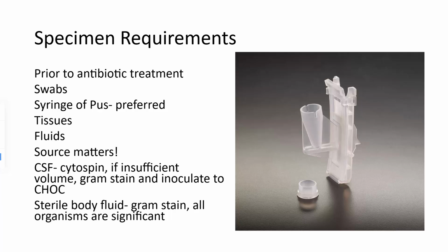And when you do that, then you go and streak it for isolation. Following the streaking for isolation, you're going to then work up the plates that you see and do your gram stain and look at it under the microscope. Fluids. For fluids, source definitely matters.